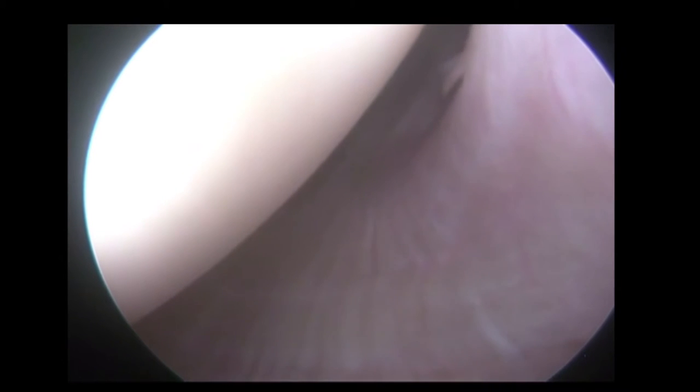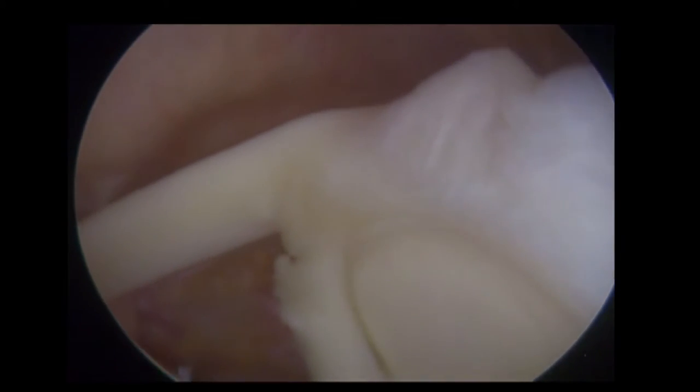We have taken the scope upwards so we can now come up the back of the labrum. This is the posterior part of the labrum and the glenoid. We are now back in the joint.